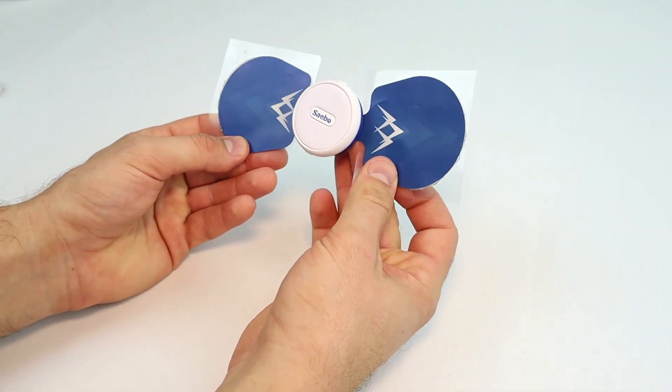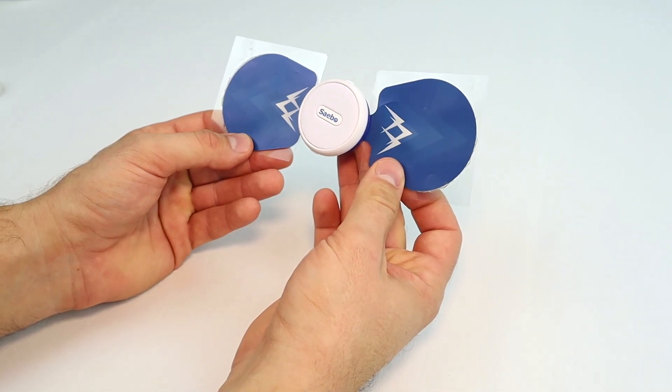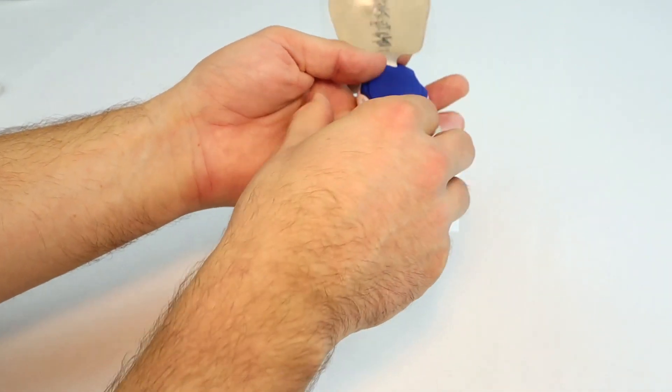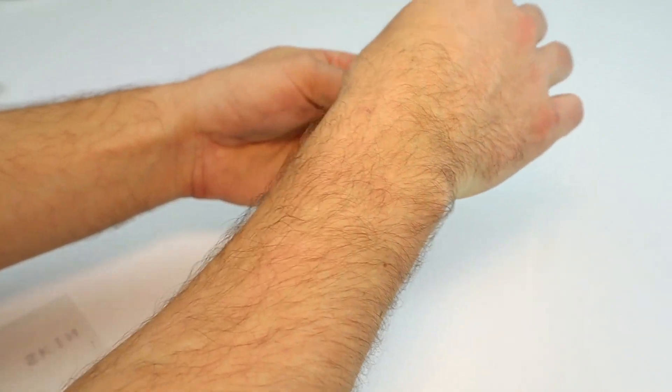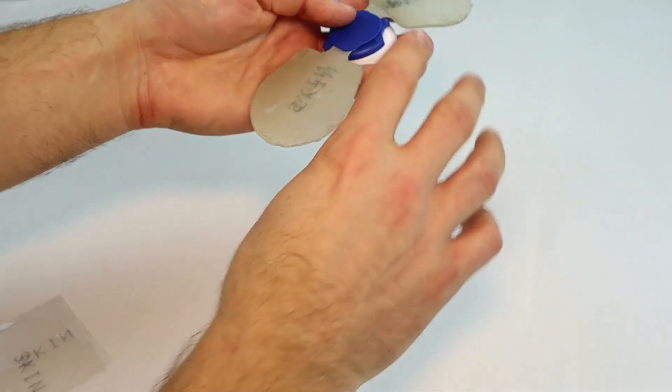This is what your SaeboStim Go will look like when the gel pads are applied. To use the SaeboStim Go, remove the plastic covering over the gel pads and save them for later. This is what you will reapply when you are finished.